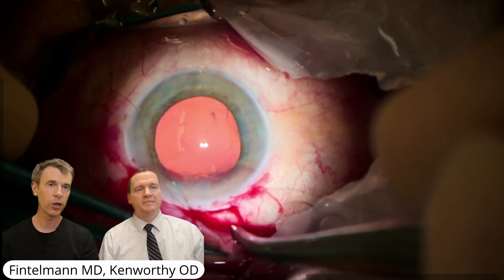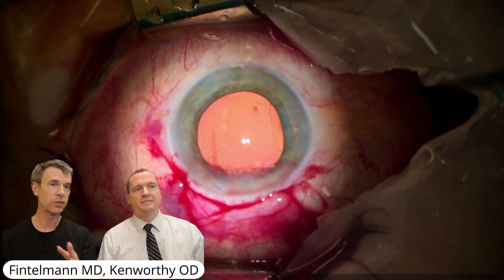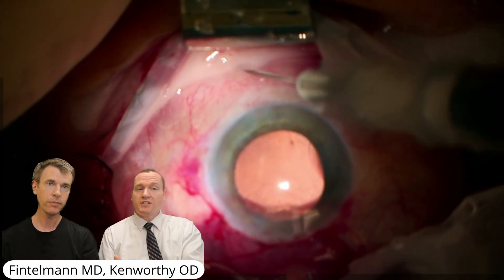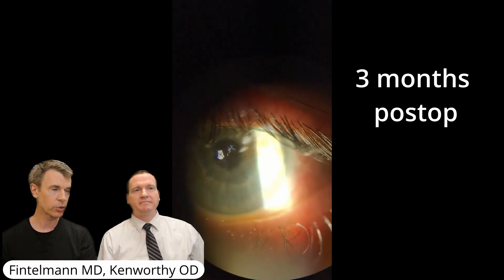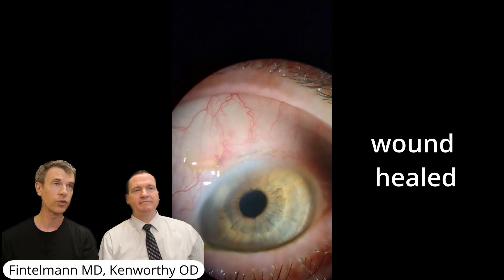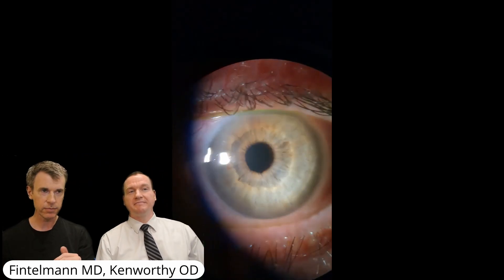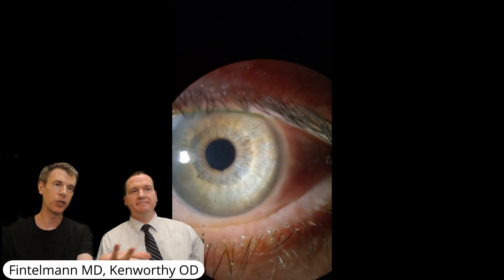This patient did extremely well. Because he was a high myope, status post buckle, status post retinal surgery, he is doing well without an IOL. He's aphakic and his prescription is around plus two. Because this is limited potential anyway, he was very happy with the outcome. For a patient with better visual potential, could they receive a lens implant later? You can do it later, but in this case there was so much trauma — I wanted things to settle and retake measurements. With a plus two refraction, I'm not sure any patient would benefit from further intraocular surgery. But a plus ten prescription might be worth it. Also worth noting: the endothelial cell count was not damaged much. The amount of phaco energy needed to remove a lens like that would be very high — so reasons for MSICS over regular phaco are: one, couldn't do it because the lens was unstable; and two, it would have required so much energy it would have damaged the cornea.